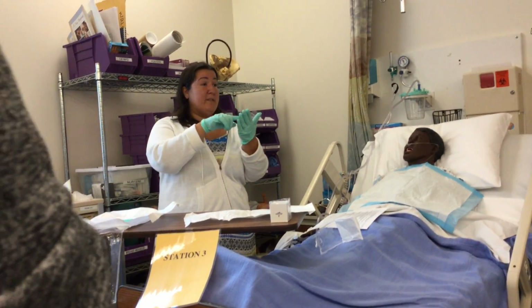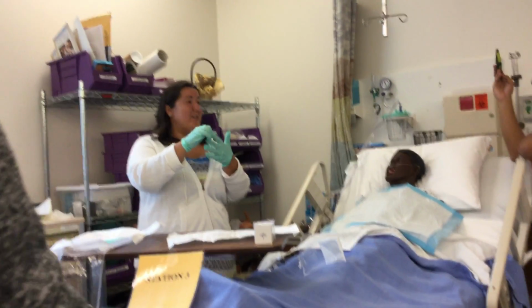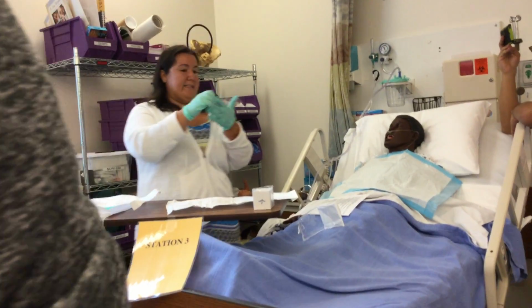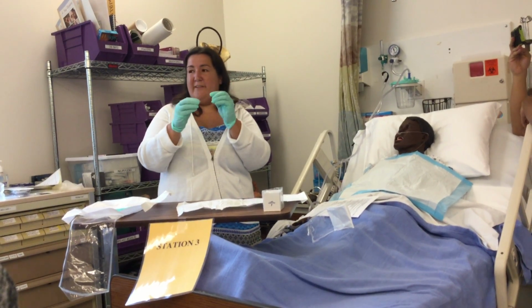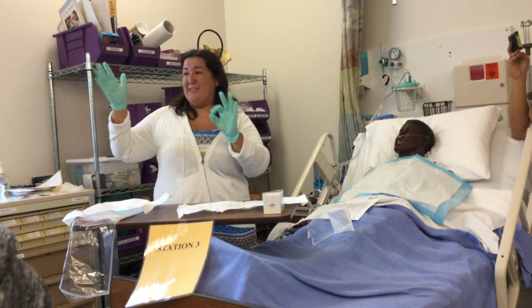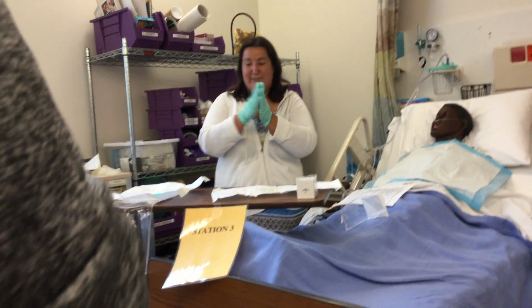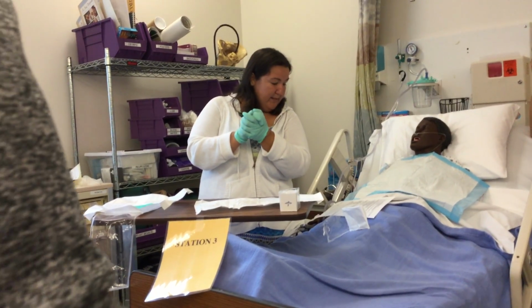Even if two fingers are in one, then just let it go. Because now I've got it on, you can fix that. Once you've got them on all the way, now you can fix that. You can fix your fingers nicely, because now you're sterile and sterile. But just be aware of that, especially when you have the one glove on, you can't reach with this hand to fix your hand. So when you get nervous, I know you understand it, those things start to happen. So just be aware of that.